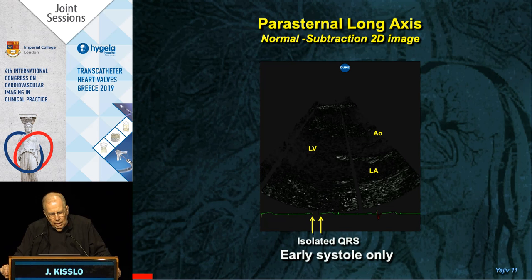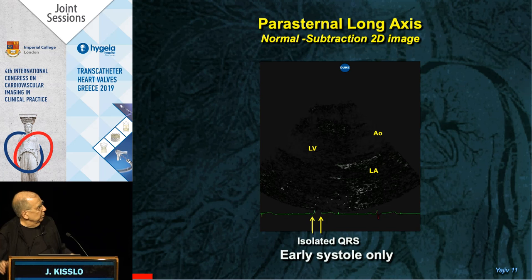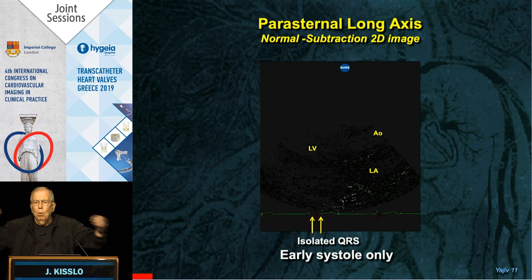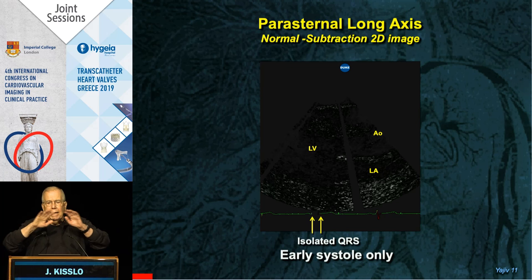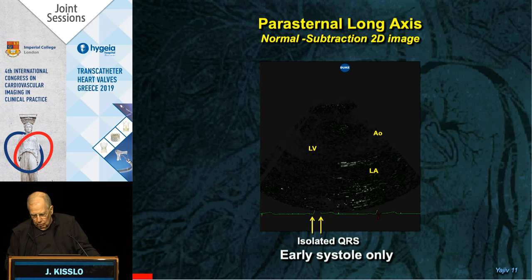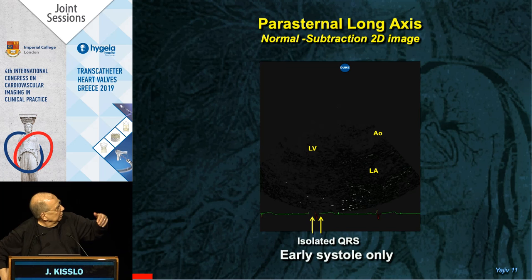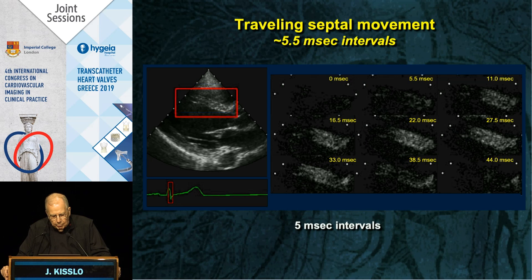Here's what we call a subtraction image — where we've subtracted one image from the other. When things light up white, that means something has changed; if it's still black, nothing has moved. Watch the septum here — this is a parasternal long axis — watch the septum light up. You can see things light up going down the septum, and if we track those over time we'd be able to map them.